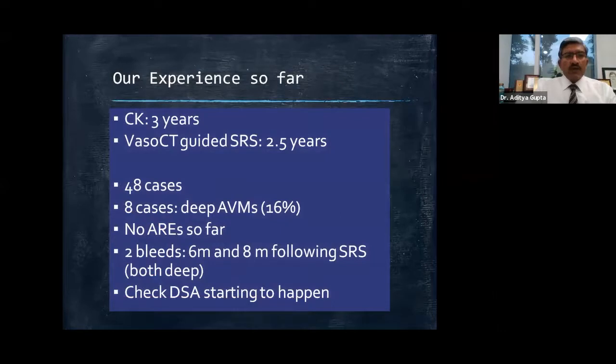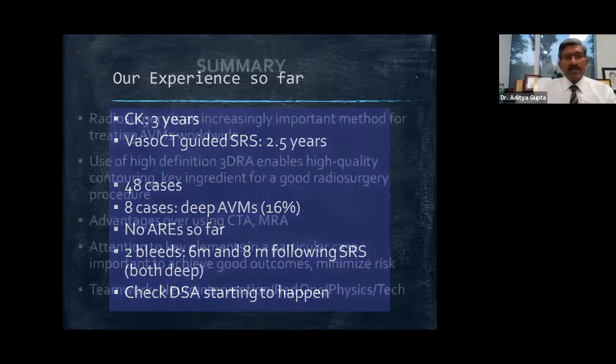Our experience so far is that we've used this treatment modality for 2.5 years, and we've treated 48 cases in these 2.5 years, of which 8 cases have been deep AVMs. But in the past 2 years, we have not landed up with a single case of adverse radiation effect. We have had 2 bleeds in the waiting period, but both were among these 8 cases with deep AVMs. And we have some check angiograms that are now starting to happen. One of the cases, of course, I presented.